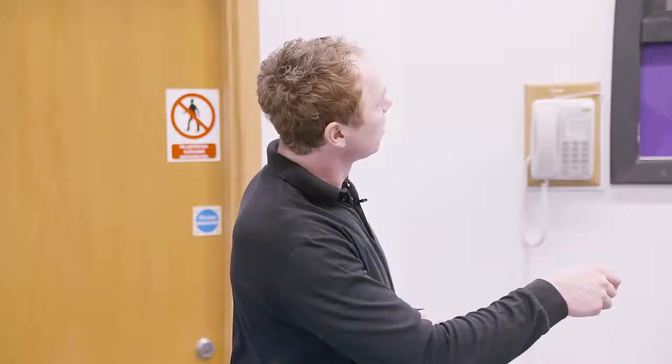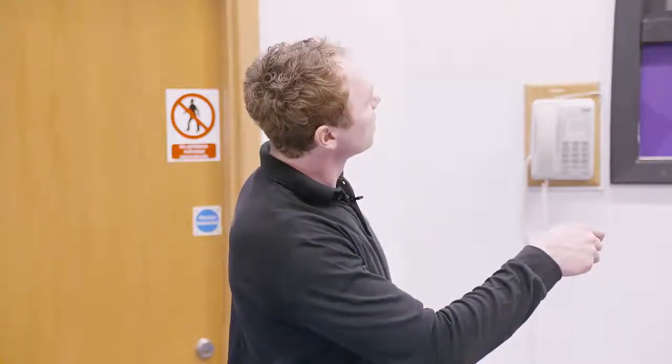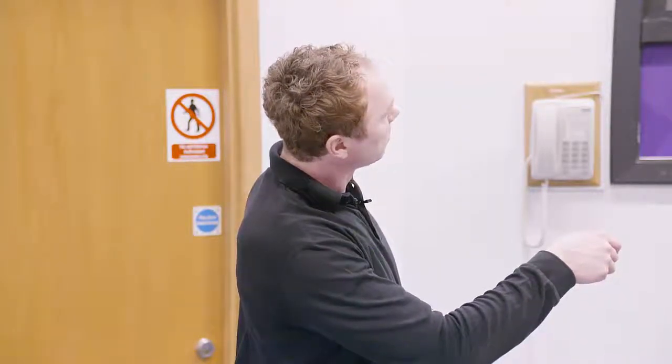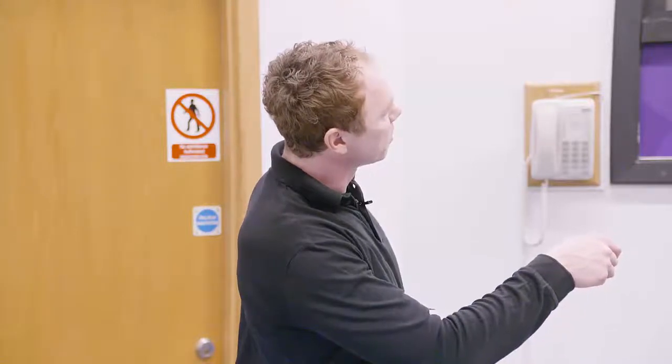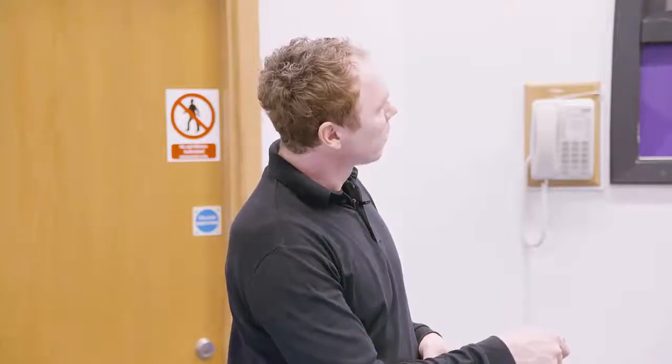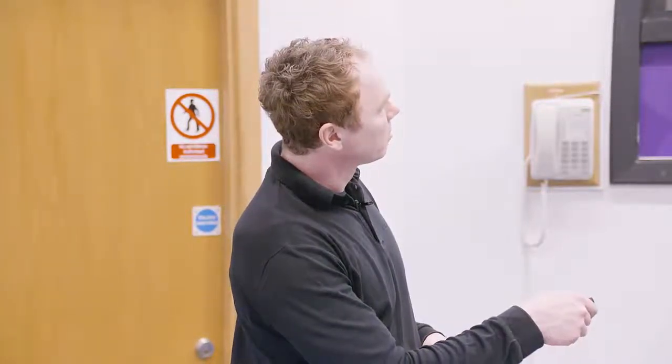That would mean that the lateral symmetry for one of the muscle groups, you have them here, is off. In this case, all the lateral symmetries are fine. Most of them are higher than 90%, which is good. For the functional symmetries, on the other hand, you can see that for both left and right, Achilles tendon symmetry is not good. For the knee, the quadriceps to hamstring ratio is also not good. This symmetry I will not explain since it's not so very important. If you are interested, you can ask later, but for now I will just skip it.